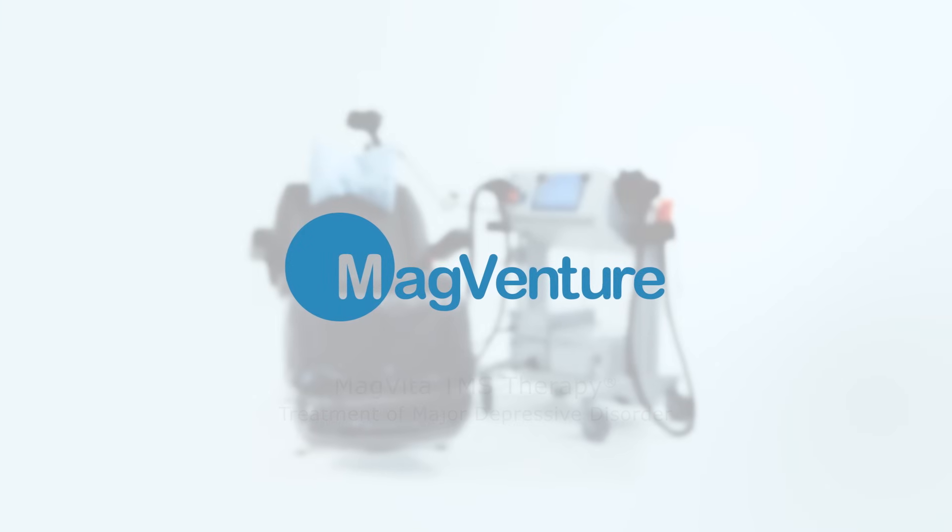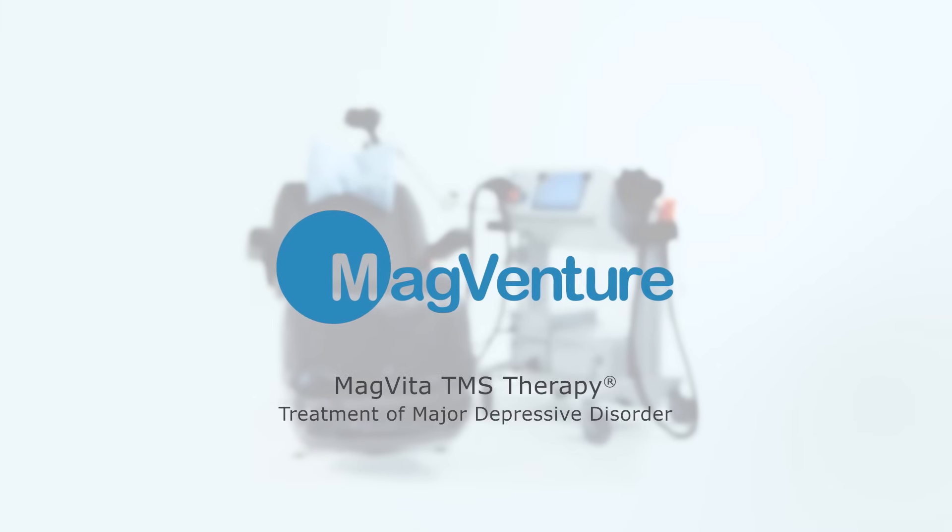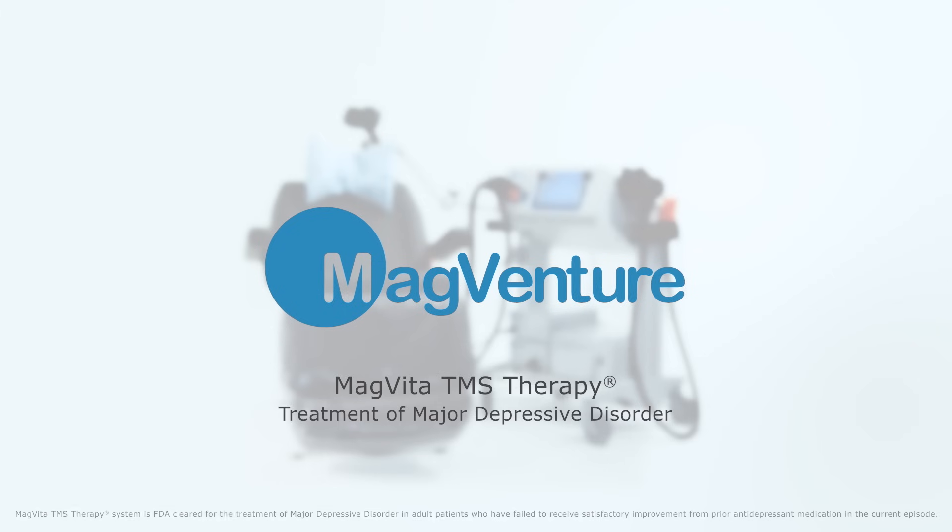This is a video demonstrating how to use the MagVita TMS therapy system. The MagVita TMS therapy is indicated for the treatment of major depressive disorder in adult patients who have failed to receive satisfactory improvement from prior antidepressant medication in the current episode.